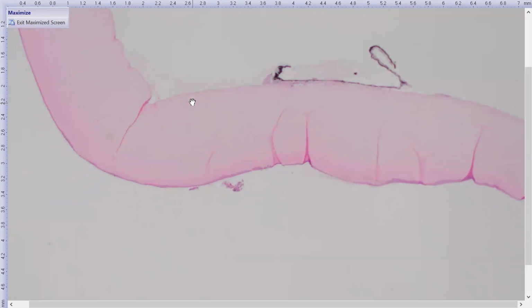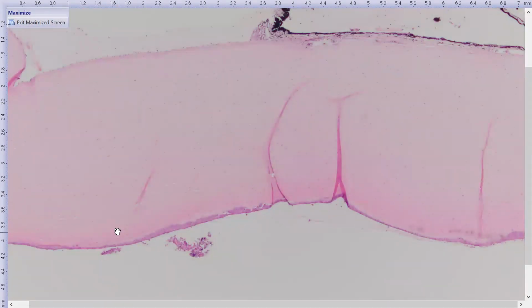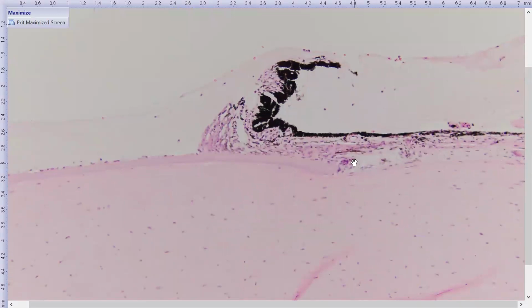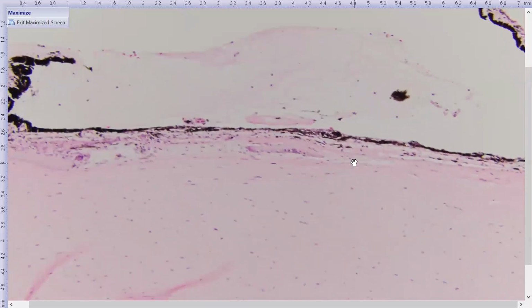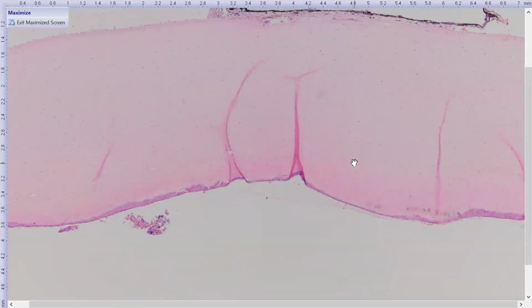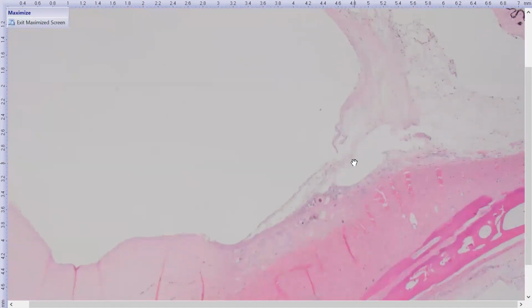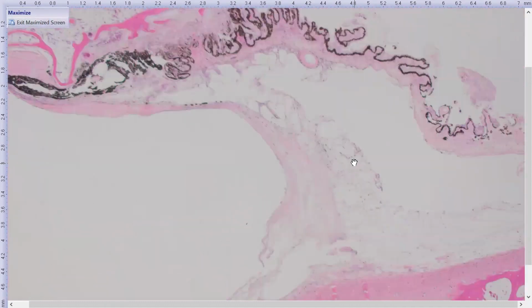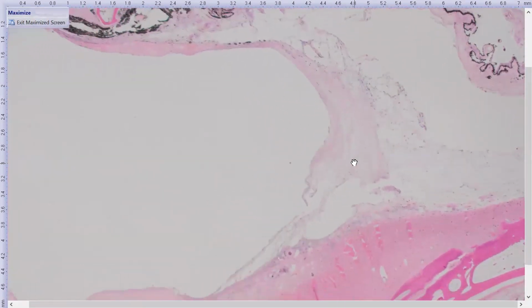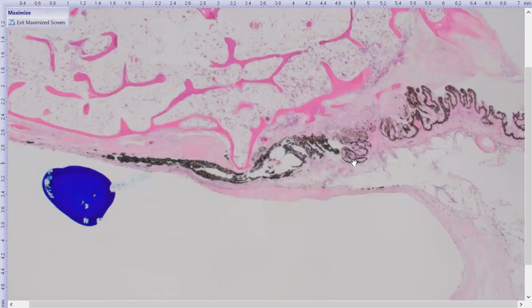All right. So the first thing I'm going to start with is that there's a little bit of inflammation in the cornea. But we also have breaks in Descemet's membrane here. And what we have kind of attached here is iris stroma. So we have a break with iris stroma plastered there. And as we go back around, we can see here's sort of where the iris base should be, but it's kind of lifted up here with the ciliary body. So we have some cyclodialysis here. There is some fibrosis and sort of just distortion of the angle as it comes up here and is attached to this mass.